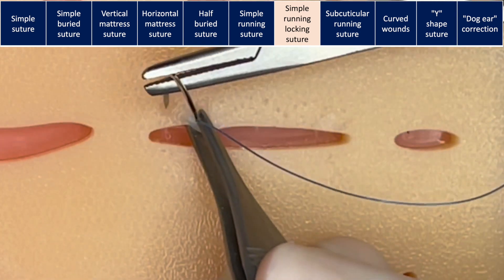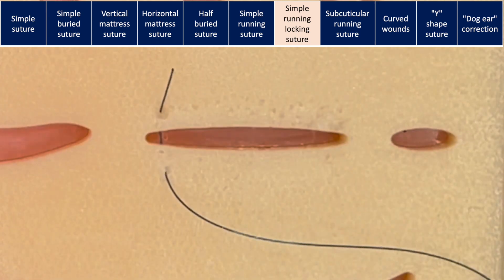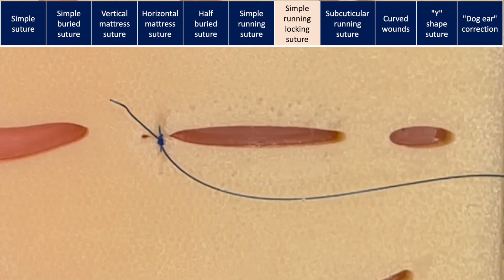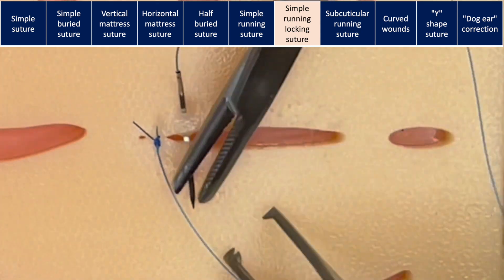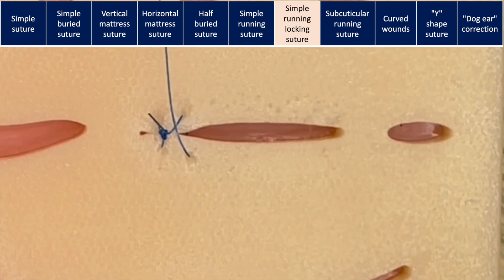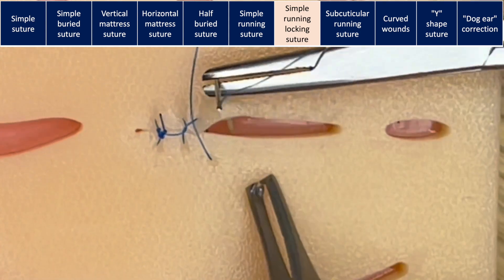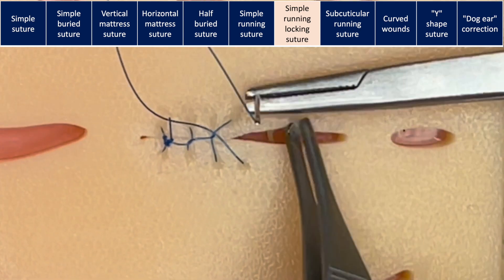This is the simple locking running suture. First, you take simple bites and tie your first one with an instrument tie. The same as the simple running suture, you advance into the wound, make your first stitch by taking a bite, and the second bite on the opposite side just in front of the exit. The difference is that you can lock the stitch each time: before you pull up completely through, you take the needle and pass it through the loop. Now you can pull it — it pulls closed and locks down. Then you go ahead and take your next stitch.